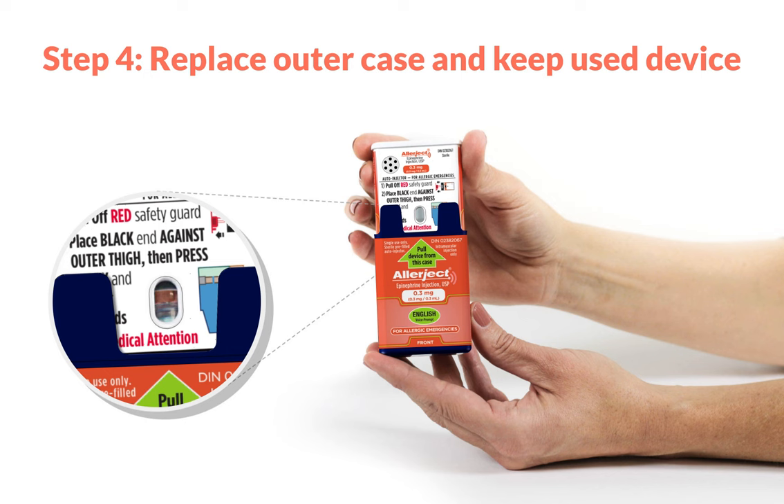Step 4. Replace the outer case. Keep the used device accessible and ready to give to emergency medical personnel.